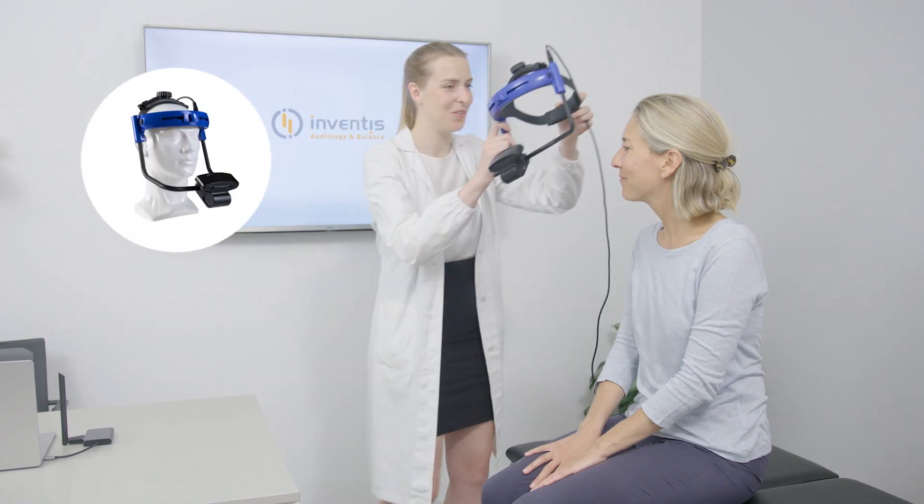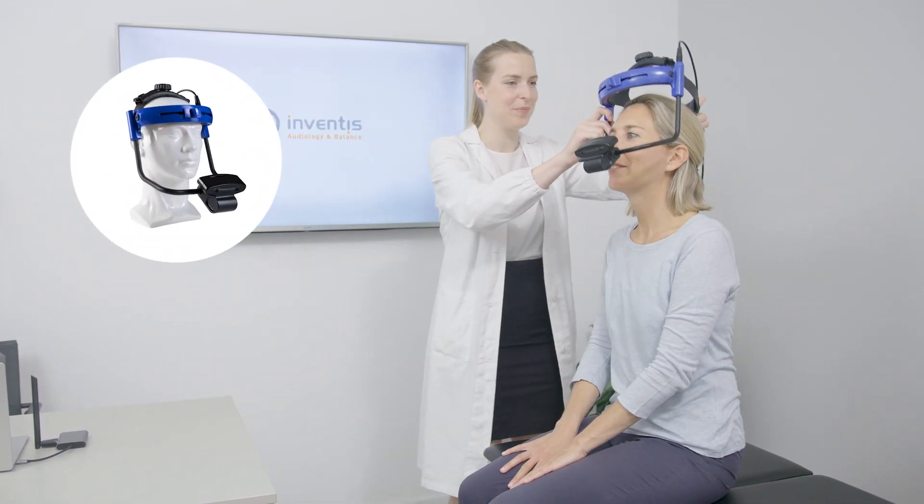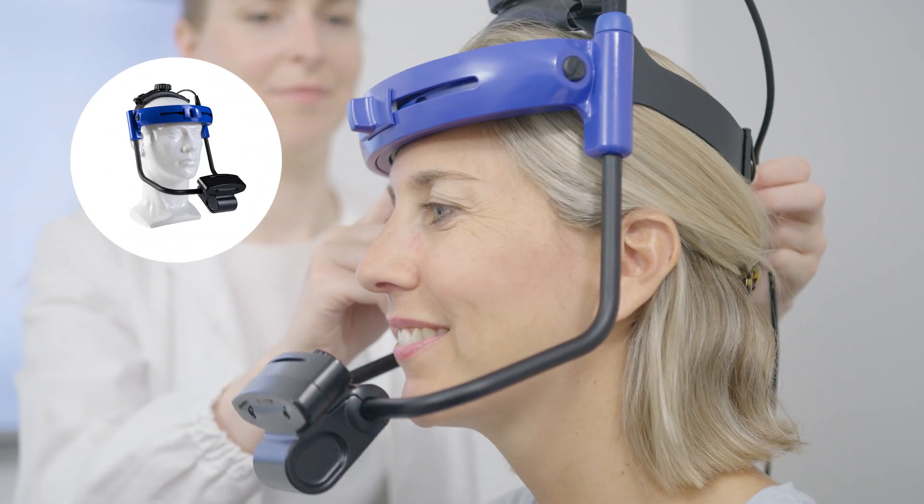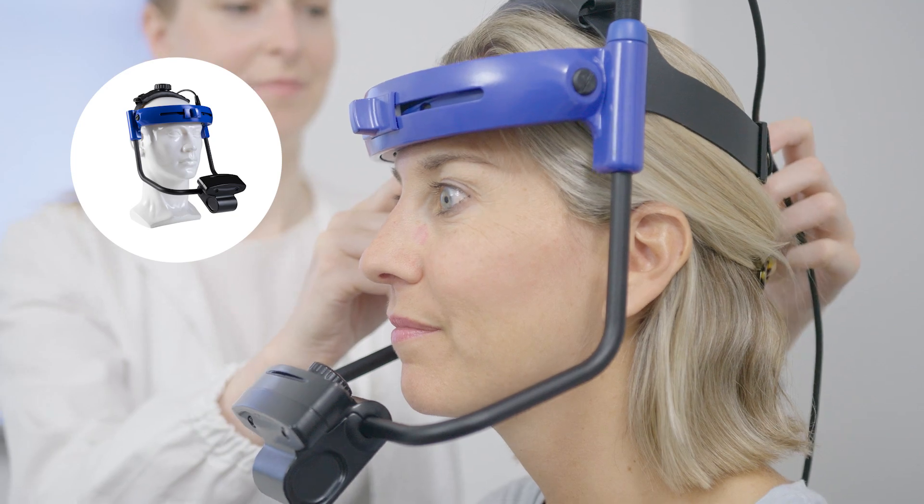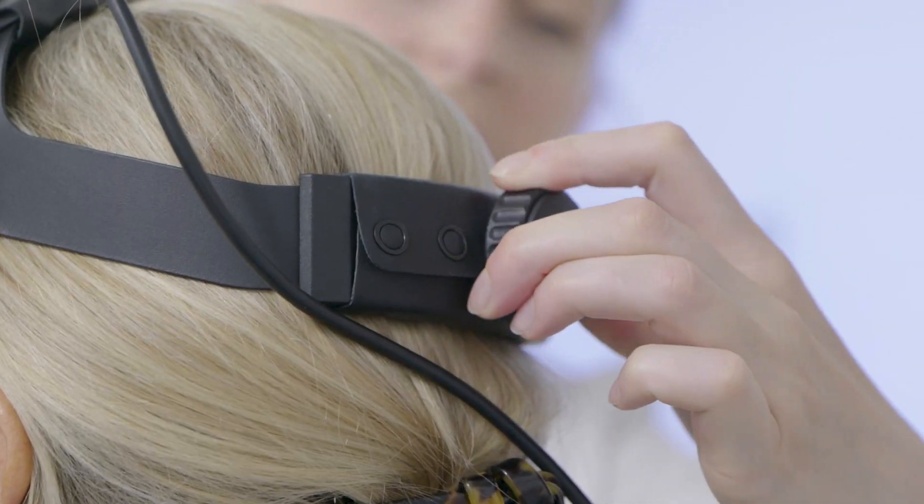These tests can be performed in a monocular configuration with the standard wired or wireless cameras or binocularly with the Vizio mask which allows true open field vision.